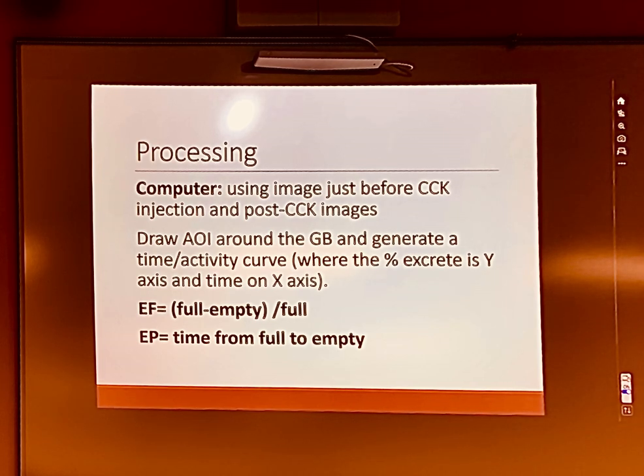Now, forget it. It's like an act of Congress to try to move images over. So in an effort to make it so, I hate to say idiot-proof, but that's really what it is. They've made it harder because mistakes happen. If you're scanning 30 patients, the probability that one day you're going to scan the wrong person under the wrong name, it's going to happen. We're human.